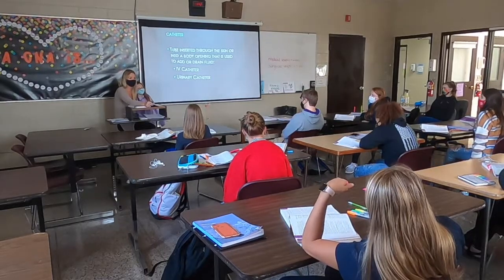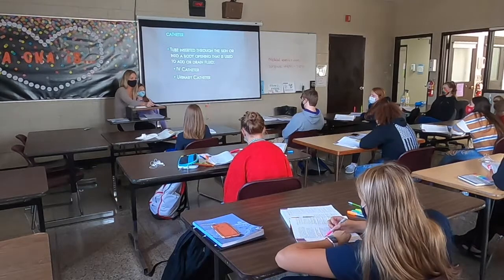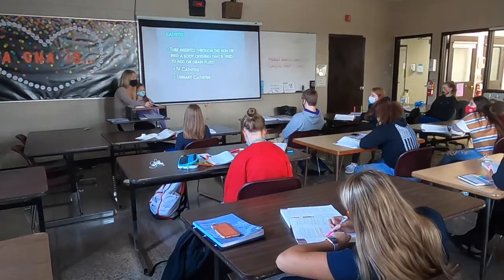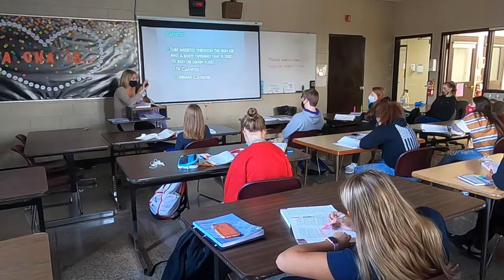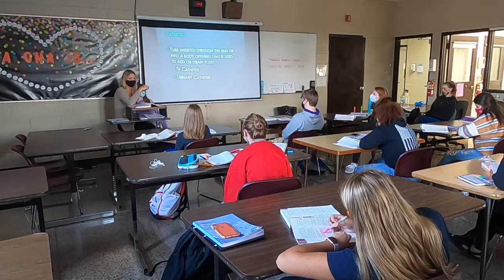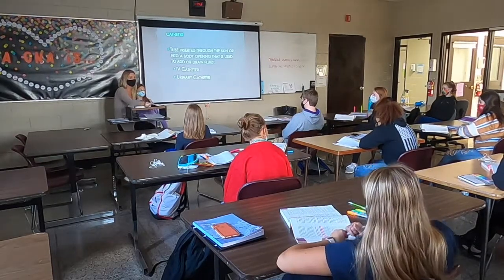catheter. Do we drain the bags? Yep, we will be responsible for draining the bags, measuring and recording that urinary output. When we're rolling Mr. Jones from side to side when we're changing his bed, do we need to be careful with that catheter? Absolutely. We don't want tugging, yanking, pulling.